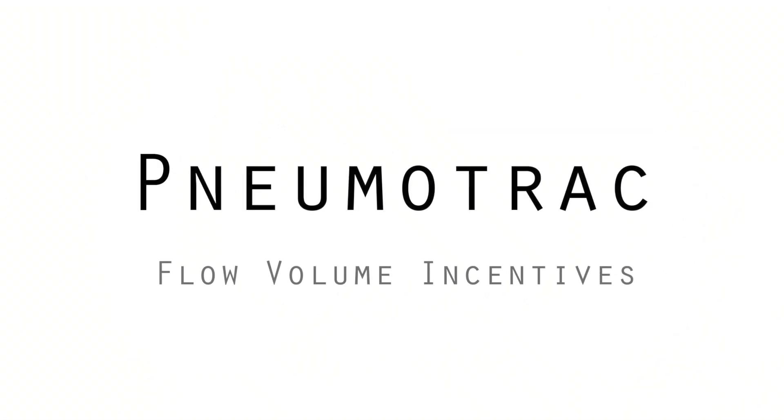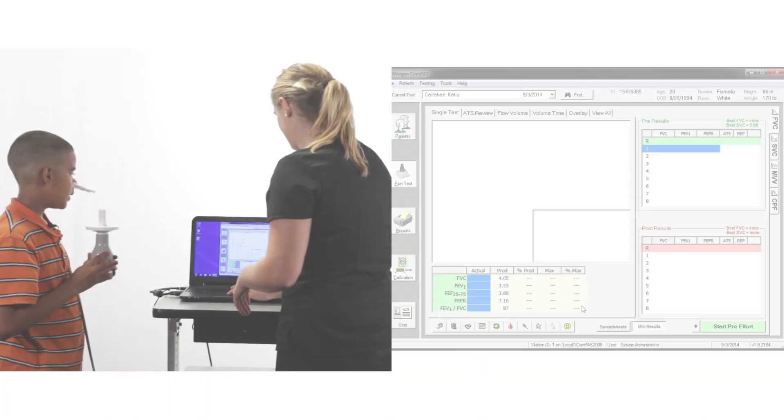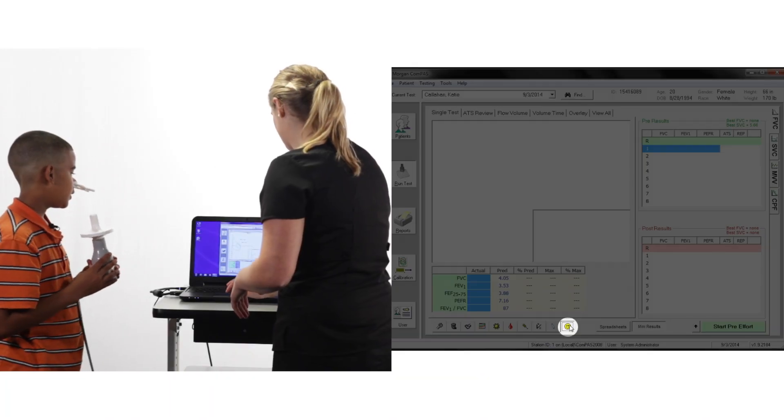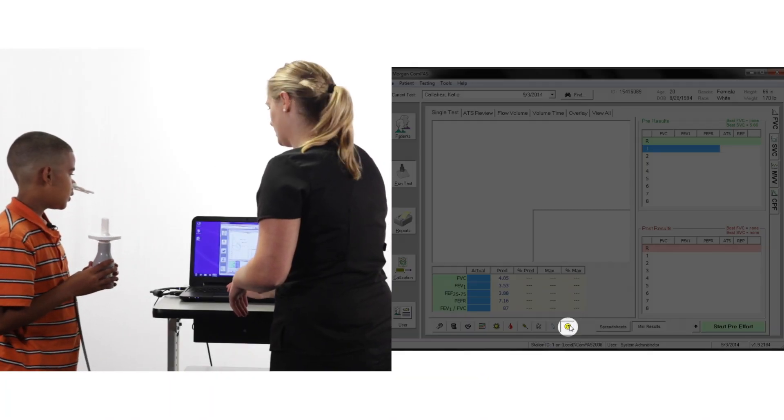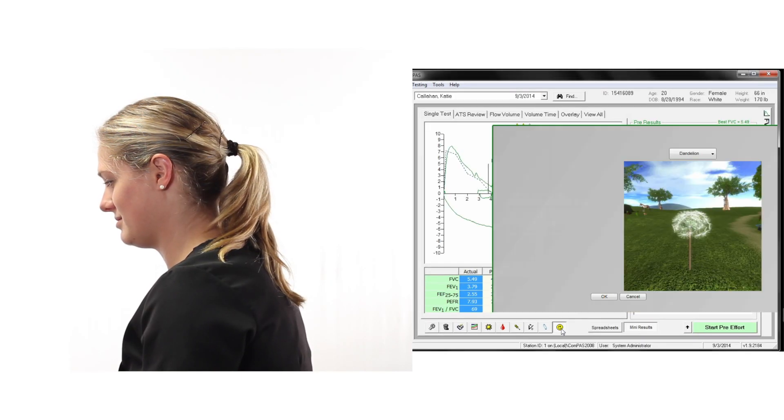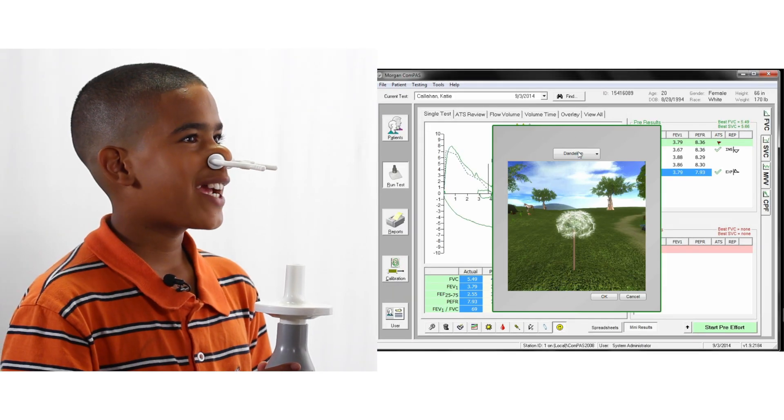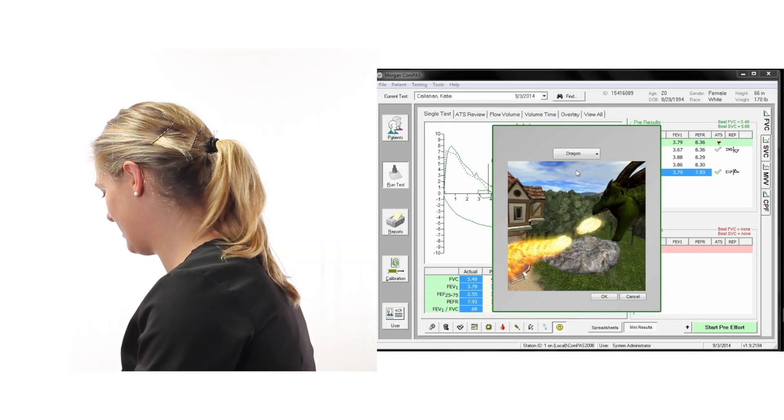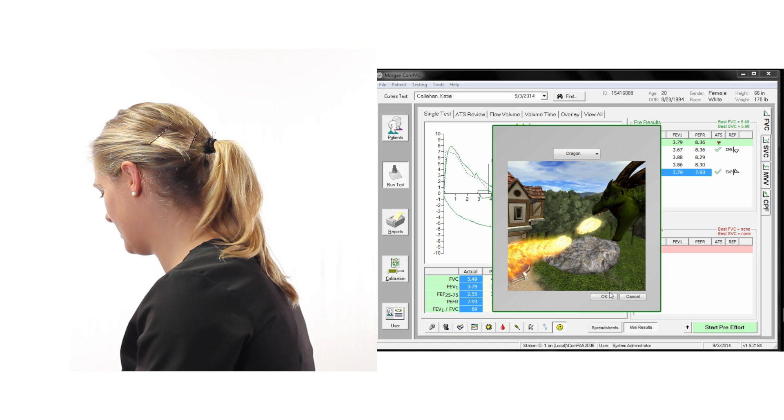Flow Volume Incentives. Right-clicking on the smiley face icon will open the incentive selections. Incentive animations can be changed during testing at any time.